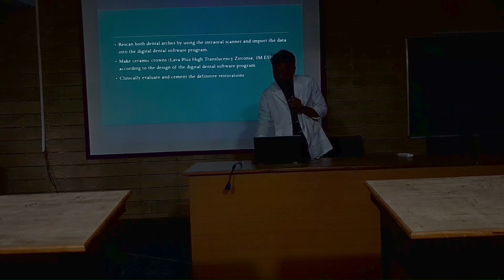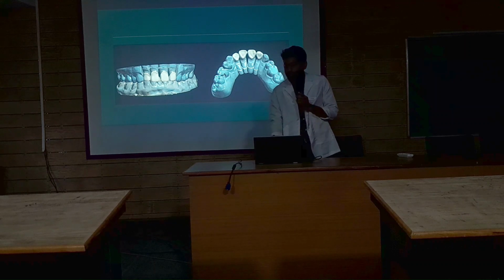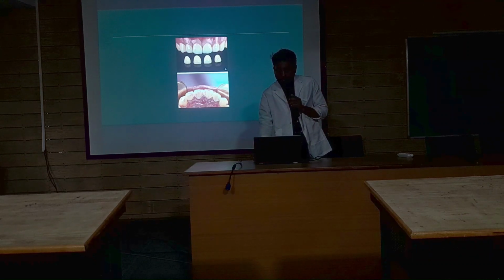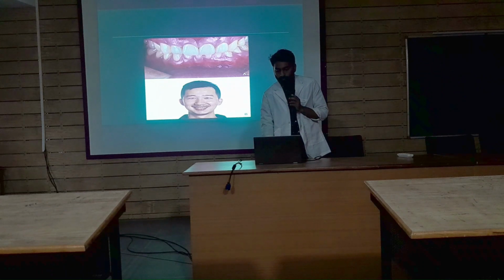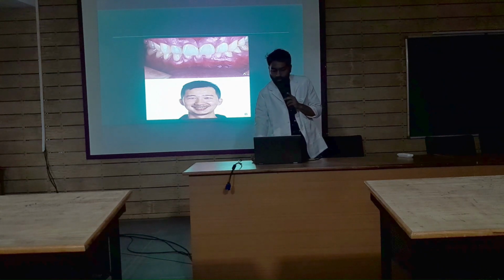We rescan both the dental arches, and then we virtually design the restoration, and then it is printed or milled using CAD/CAM, and then we place the restoration. So this is what we have in the case of the virtual dental patient.